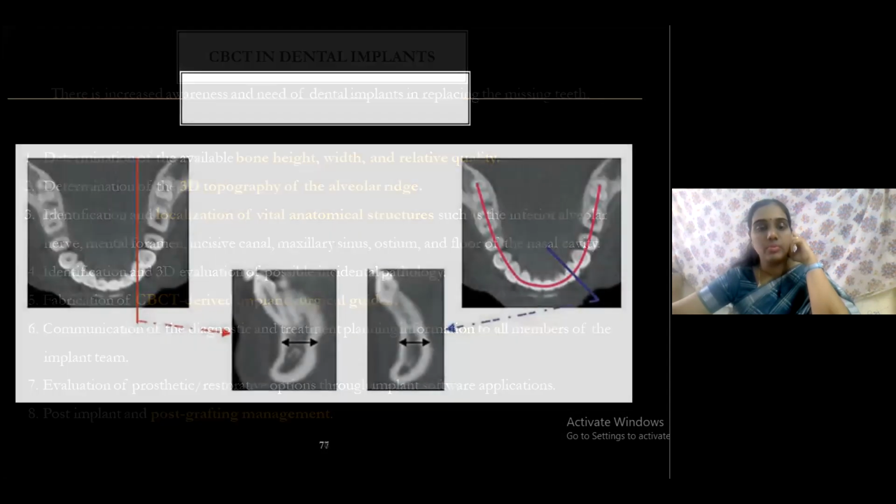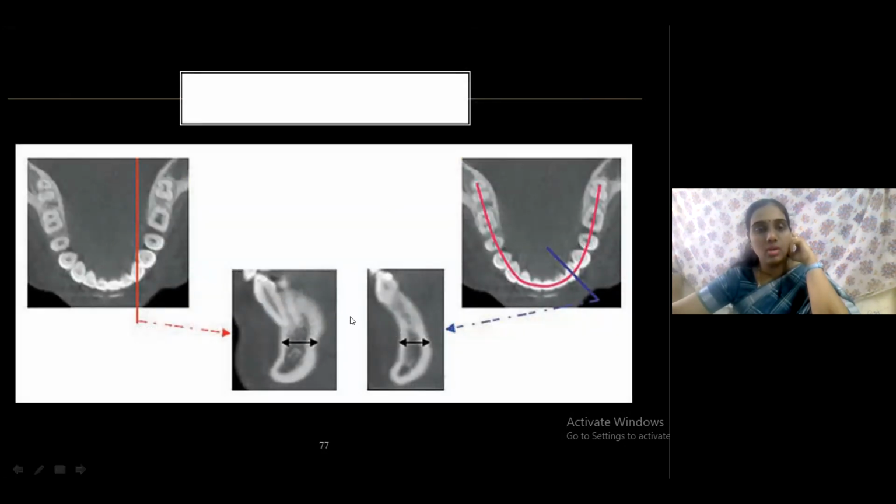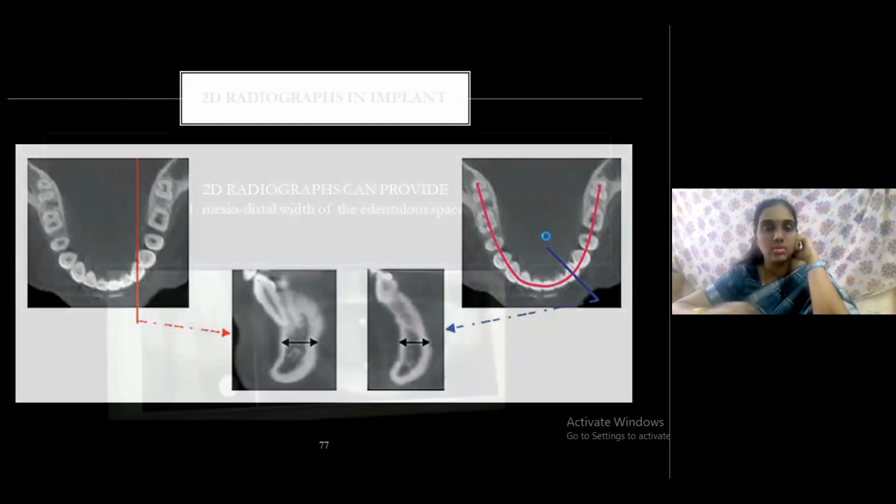It is really helpful. That is why there is a specific implant window in all CBCT softwares, and you have to take a transverse section that is exactly perpendicular to the long axis of the tooth. Other kinds of sections should not be taken, as they will give you a misinterpretation that the width is very large. This kind of transverse section has to be taken in implant planning to know exactly the thinnest width available in that projection.